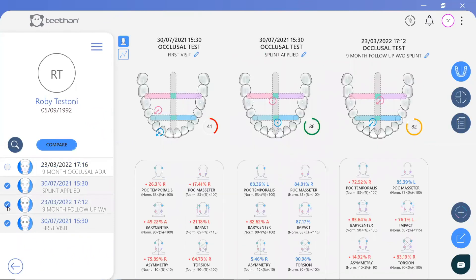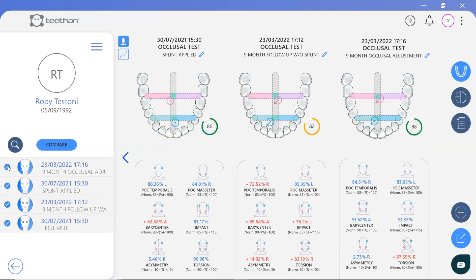The patient returned after nine months for a follow-up and was reassessed, this time without their splint. Again, a vast improvement compared to the patient's first visit. However, there was still room for improvement. During the same visit, an occlusal adjustment was performed by the dentist and a further occlusal test was recorded, providing the highest global index to date of 88%, with both circle symbols sitting within the green zones of optimal occlusion.